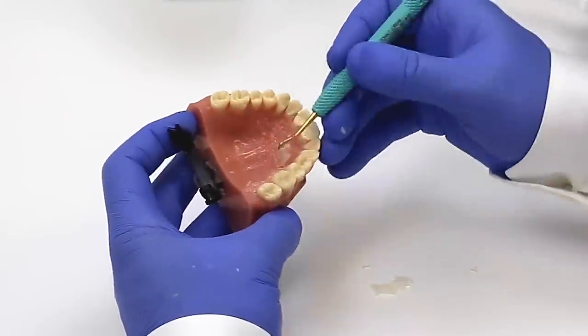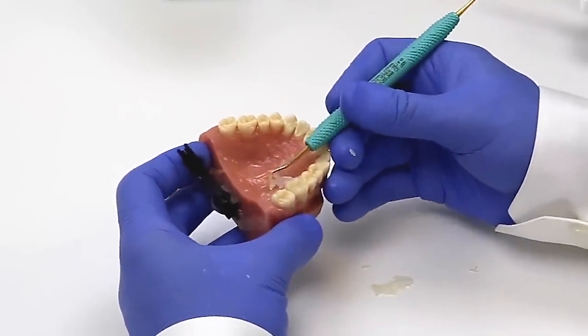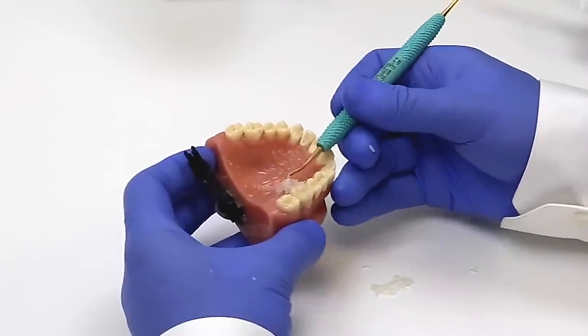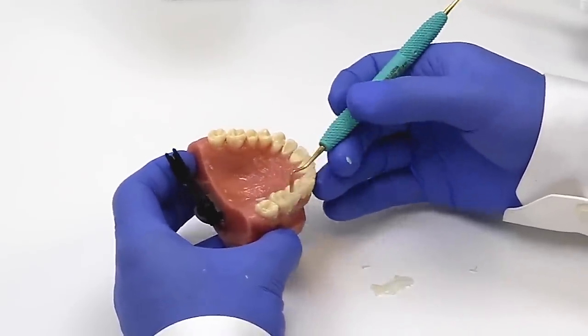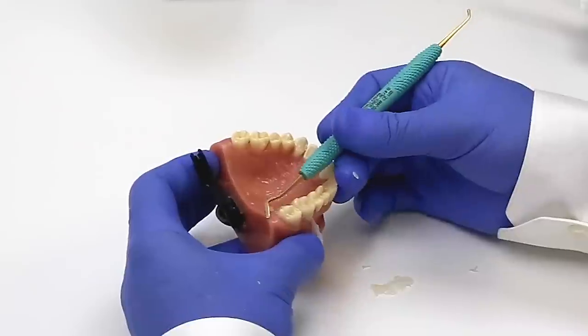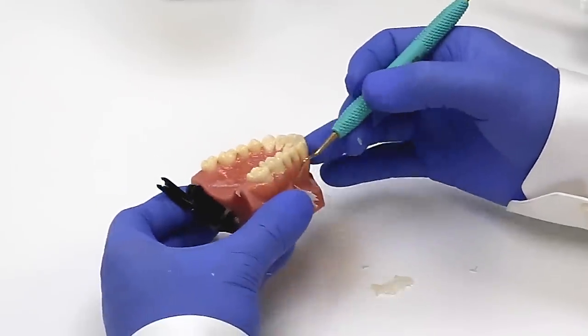We'll just get rid of that. We'll go on to the lingual. The same thing. Still an onion skin amount of excess. Very, very little. Breaks off very easily. And this is all due to the accuracy of Template.